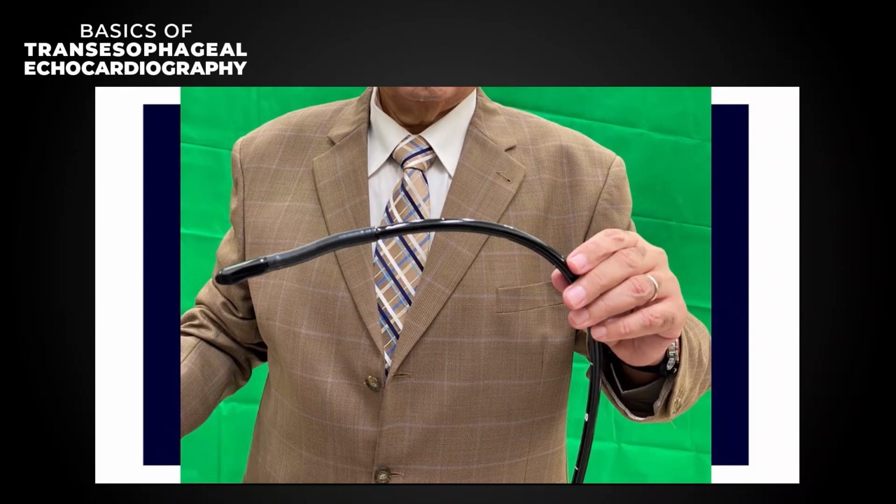What are the contraindications for TEE? The absolute contraindications are patients who are unable to swallow or who have difficulty swallowing, because those patients might have esophageal problems like esophageal strictures for any cause. So if the patient gives you a history of dysphagia, be careful and don't go.